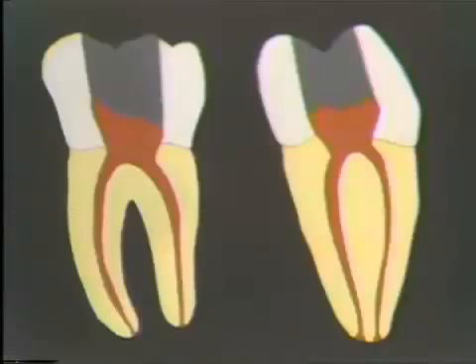This graphic will show you what's going on inside the tooth. To get into that mesial buccal canal, you get your file over to the distal lingual, and it'll go right on down into the canal. You can see that it would be hard to get in coming straight down. You'd hit the floor of the pulp chamber.